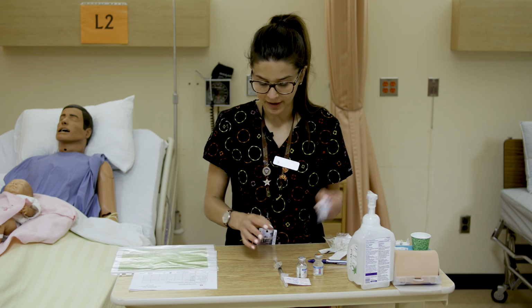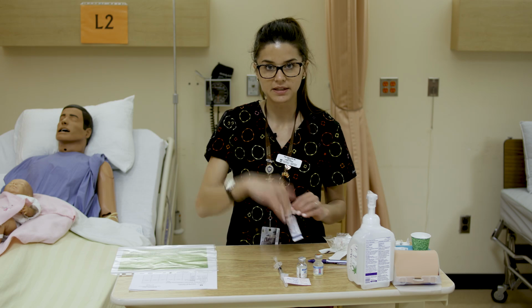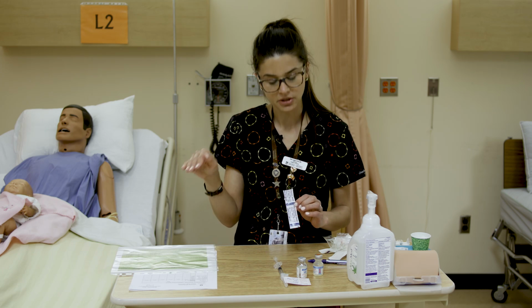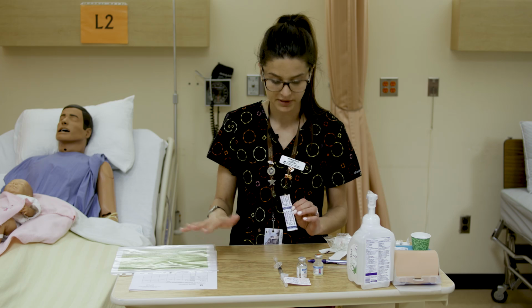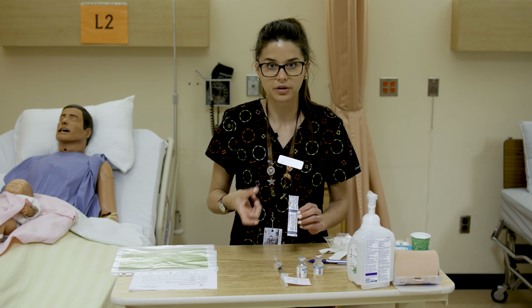So for IM injections, and now you can kind of put it all together. The muscle is the deepest tissue that we're going to go to for injections. So first we had our intradermal, which is the top layer, your dermis, then subcut is under that, and then intramuscular or muscle tissue is below that. So you can probably already imagine that we're going to want to go with a longer needle.